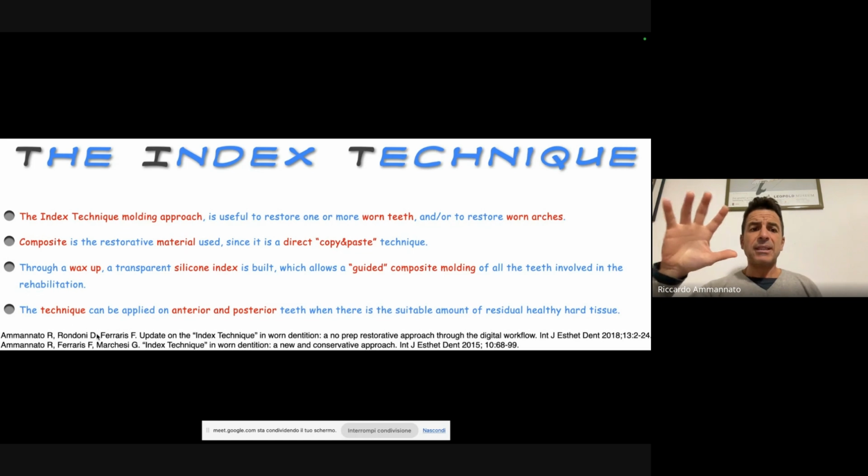However, the Index technique is a molding approach that is useful to restore one or more worn teeth, especially to restore full arches. This is a direct molding approach, so the material that we usually use is composite, okay? And through this direct copy-paste approach, we have a wax-up that is delivered by the technician based on an aesthetic and functional analysis, on all the etiology and all the findings that we did in the beginning.